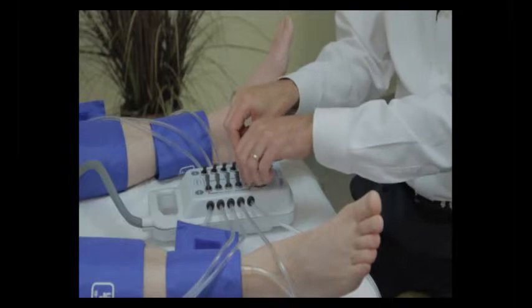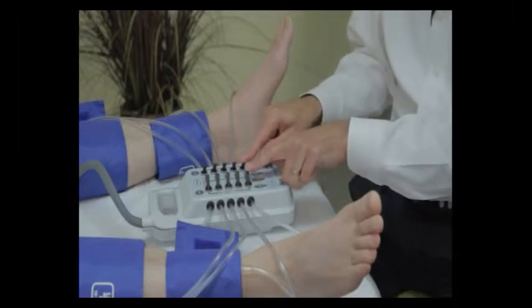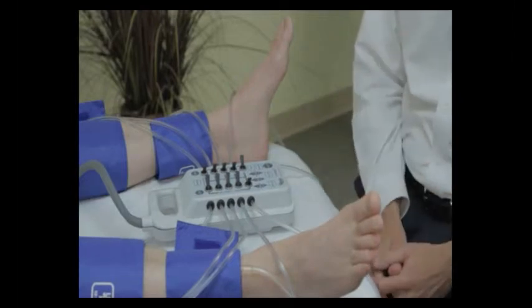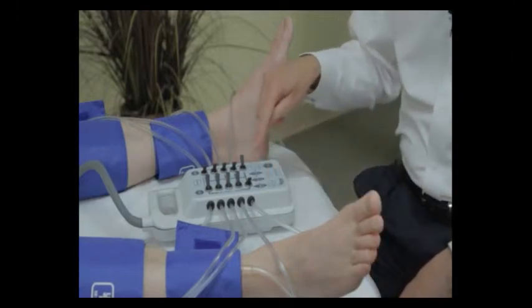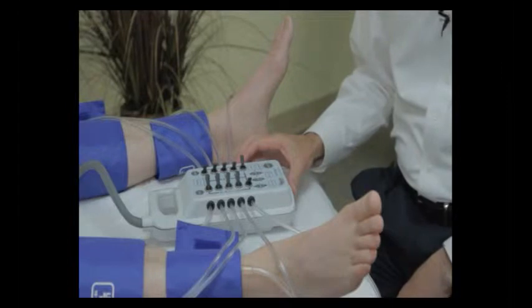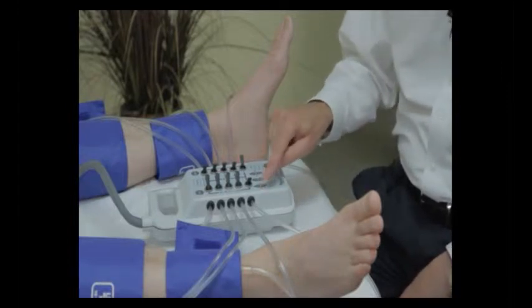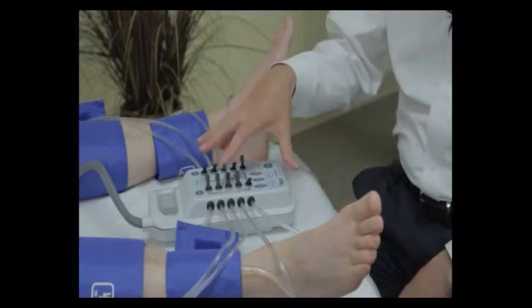I'm set up now to do a pulse volume recording at the ankle, so I'm going to take number five left and right, move them into the out position. You'll also notice there are remote control functions on your multiple cuff selector. I can inflate, deflate, capture, set my volume, gain and baseline, all from here.